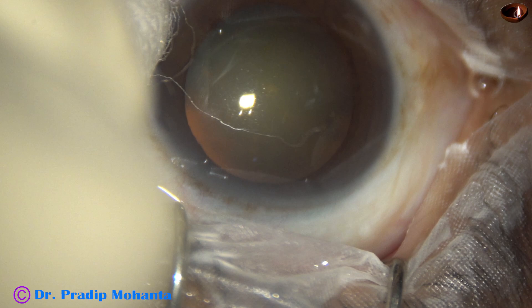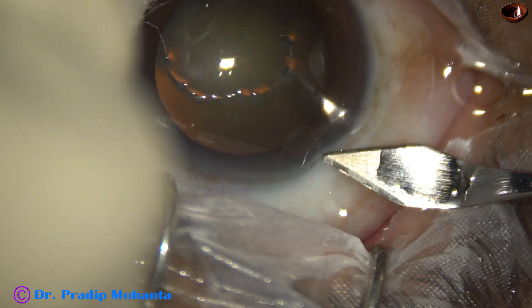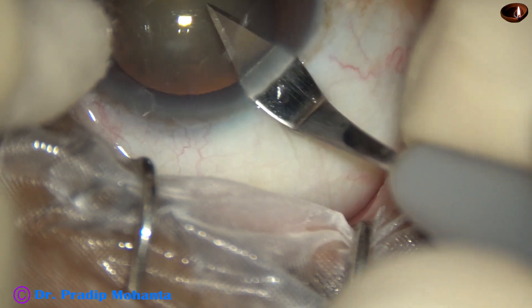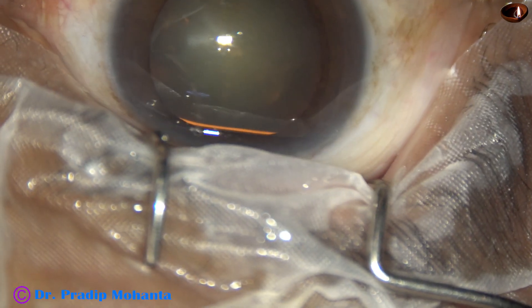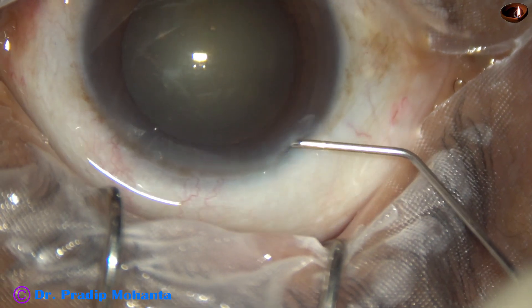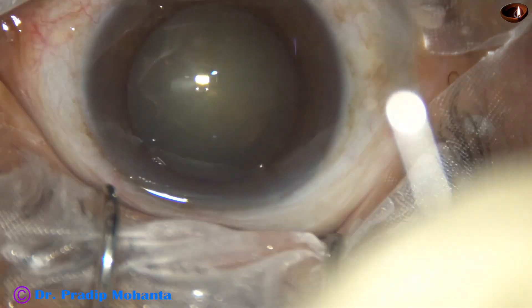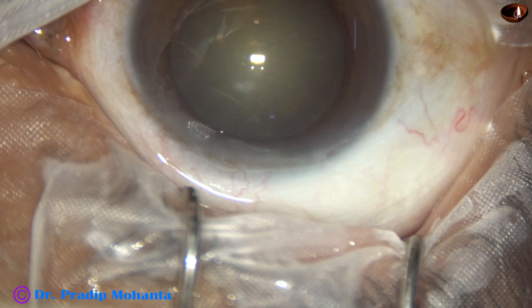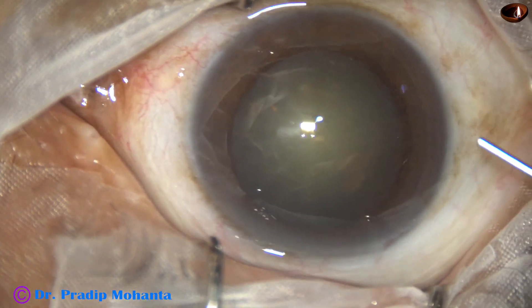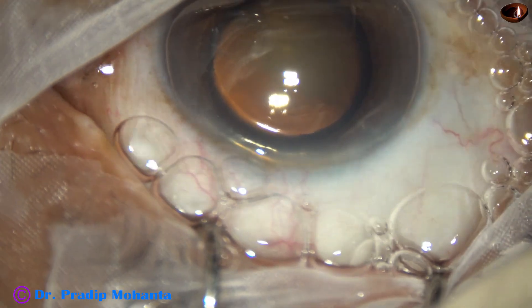This is a cataract with grade 2 plus or grade 3 nuclear sclerosis. This is the main incision with a 2.8 millimeter steel keratome. The site of incision is at around 11 o'clock. This is phenocaine — the patient is under topical anesthesia. In this case, I have decided to stain the capsule so that I can demonstrate the capsulorhexis very well.